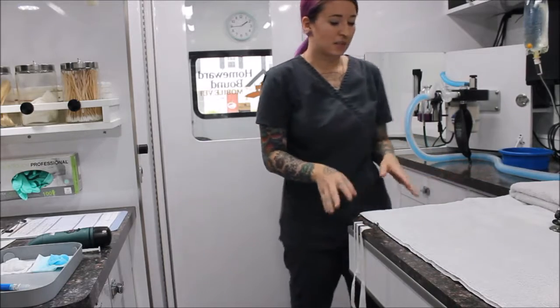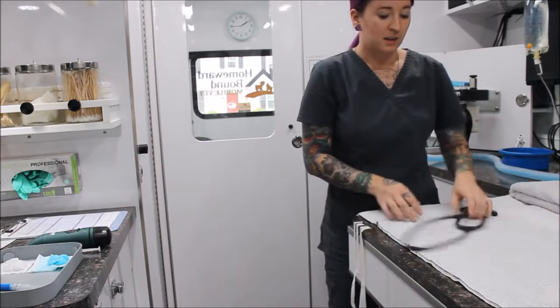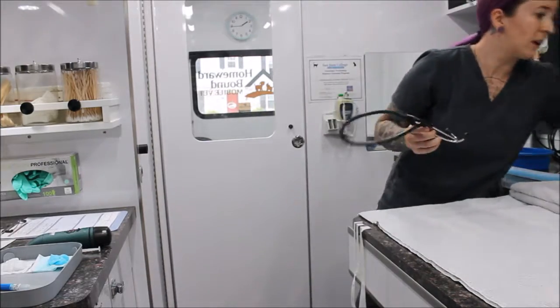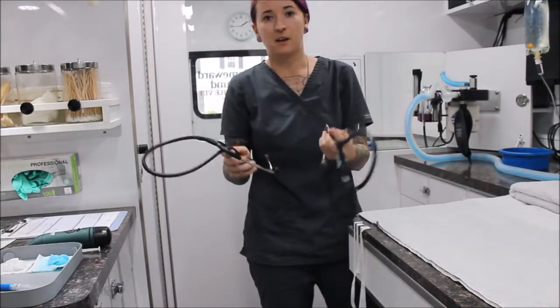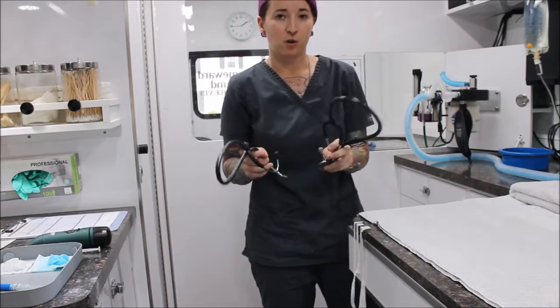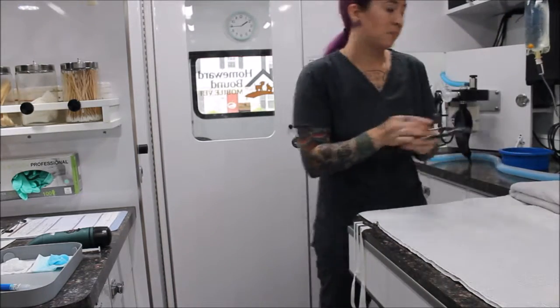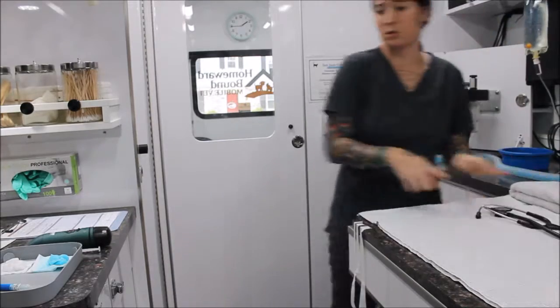And then the next thing I want to make sure that I have after that is a properly working stethoscope. So we actually have 2 stethoscopes in the area, and both of them I have confirmed are working. So I always have a backup in case something happens with my first stethoscope.